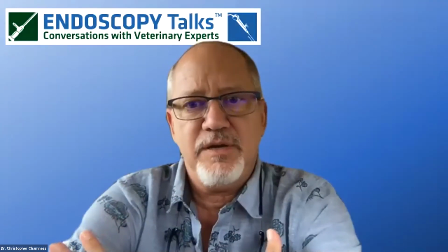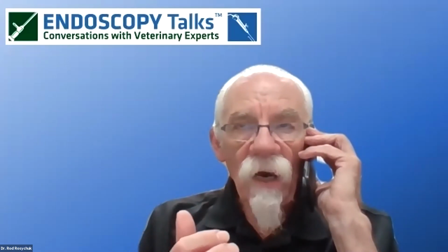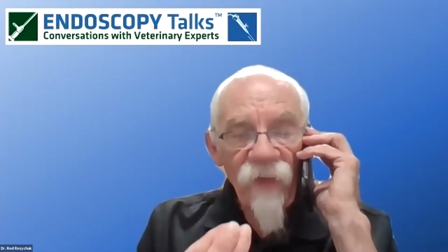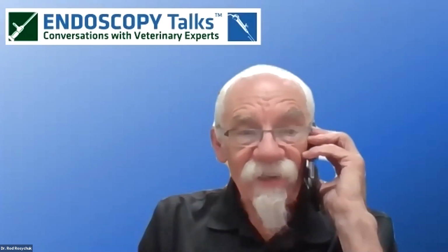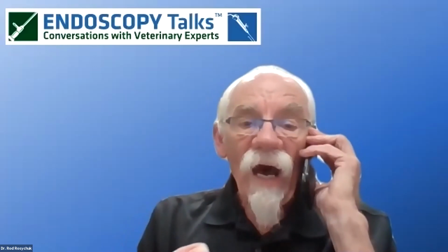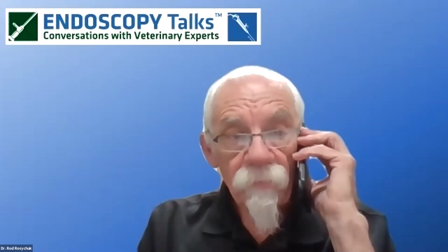Okay. Do you collect your samples for culture before flushing, or do you use the debris from the flushing? Actually, I always initiate my deep ear cleaning by aspirating some material, as deep as I can go in the ear, and I save that for culture. I might not even use it, depending on what I see in my cytology, but I do sample deeply in the canal before I do any flushing.